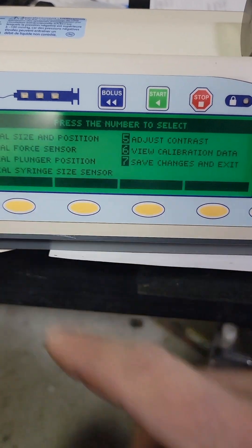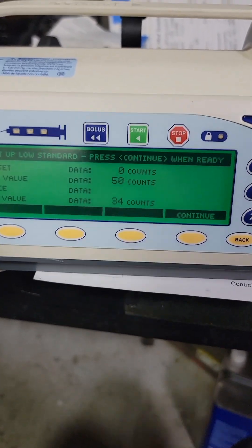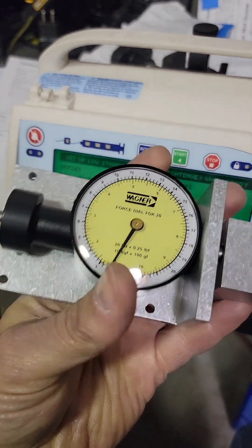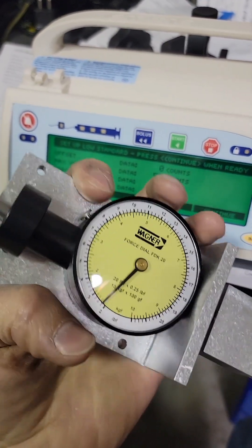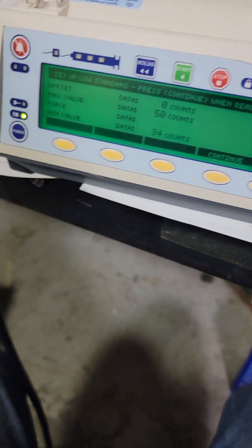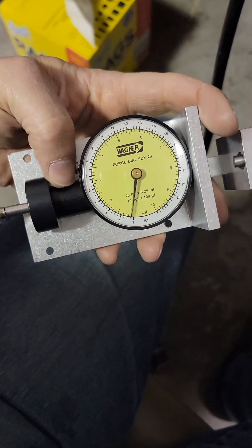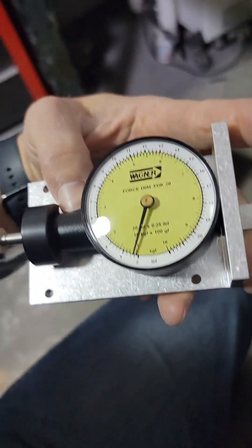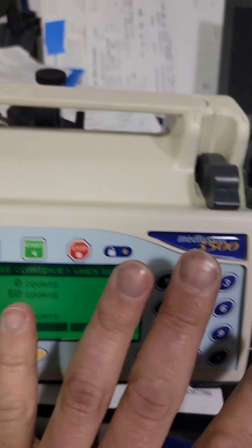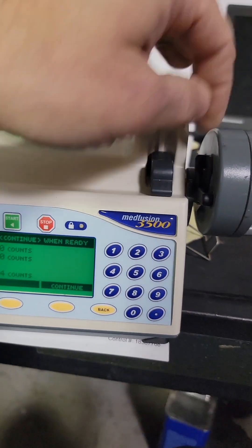Next we'll do the force sensor — number two. This will tell you if you have a good sensor or not. For this test, make sure you are zeroed — see this little button right there? That's how we zero our gauge. As you see, this is not a momentary — it holds in place. And zero. Granted, that is not an exact zero, but let's not worry about that. With nothing loaded, open and close this, make sure it's not sitting up on anything or hanging up — so it's at zero. Press continue, wait about 40-50 seconds for this to finish zeroing.